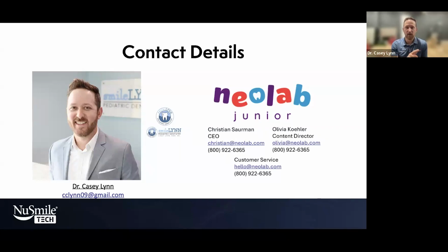With Orthobrain that we utilize, you also have to submit intraoral photos. So your traditional series of your orthodontic photos: full palate, full mandibular, your buccal bite, your anterior, your patient standing facing you, portrait style, and then a pano. There's no Ceph needed with their tech. And with Orthobrain, you send that scan and your records to them, and then they have an orthodontist treat and plan the case. So they'll do custom attachments and your buttons and roll it through the software for, hey, this is how many aligners we're going to do, this is how fast you're going to rotate them. And you can be specific as to, okay, I want this here, and I want this rotated. And you can just bounce back and forth with the ortho.